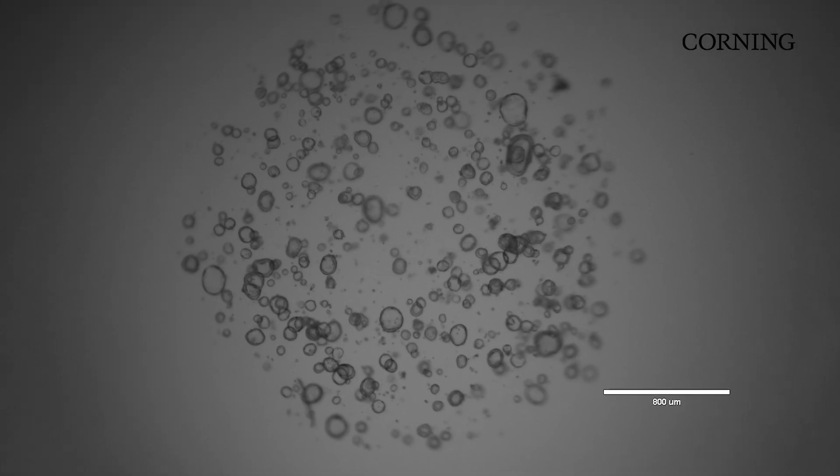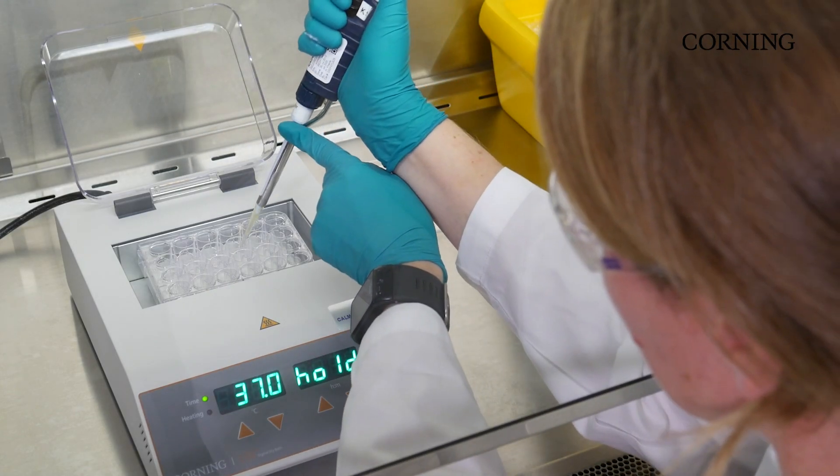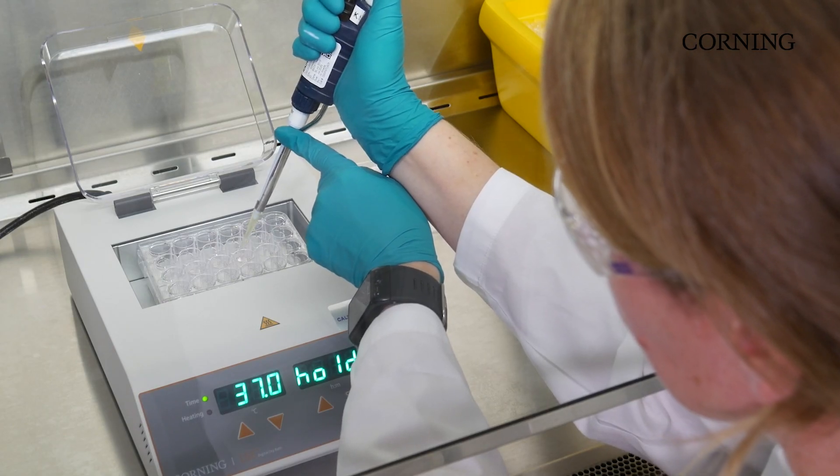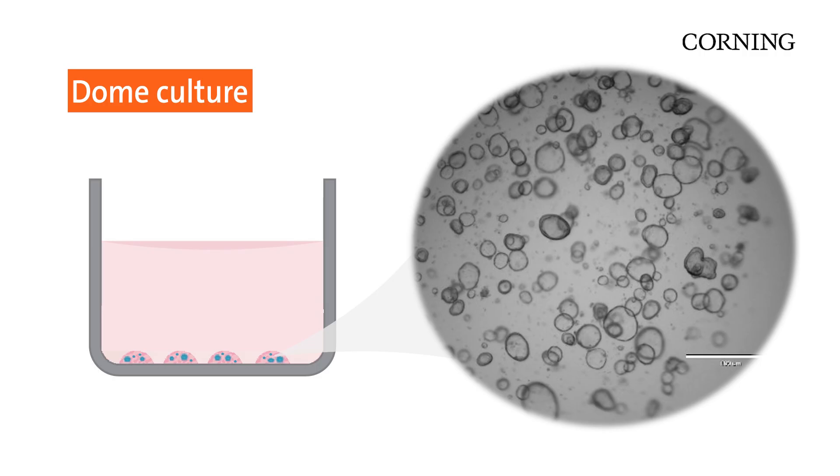Dome culture is typically used when working with patient-derived organoids, when there may not be a lot of material to work with. Here, small droplets of Matrigel Matrix and cells are plated onto the cell culture surface. The result is a fully embedded culture, but with the smaller domes, the focal plane is much more uniform than with a more traditional embedded technique.